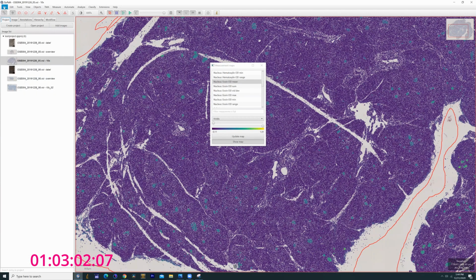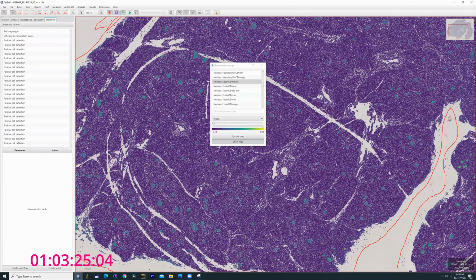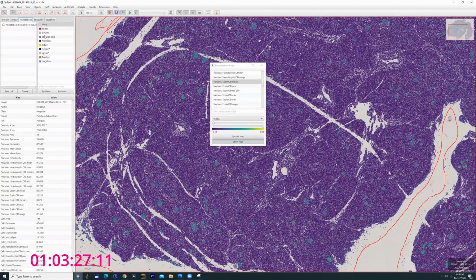And the beautiful thing is, all you have to do now is hit save and close the file, and all this stuff is nicely tucked away. And when you come back tomorrow or whenever, besides filling out your data set, so all your sections you want under any given stain, before you export everything, you can go back under workflow. You can find your settings for prior versions. If you want to, you can get really fancy, start labeling tissue based on specific stains. But again, that's beyond the scope of this talk. I just want you to know it's out there.